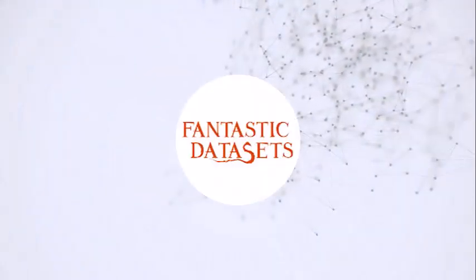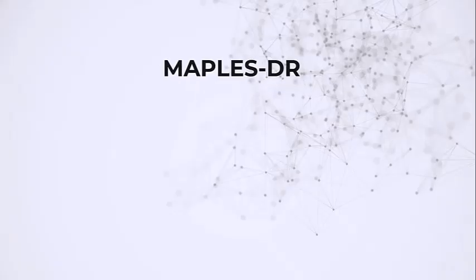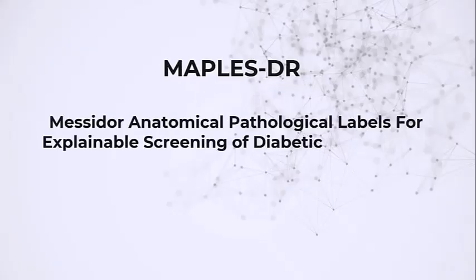Welcome to Fantastic Datasets and Where to Find Them. In this video we will talk about MAPLES-DR dataset. MAPLES-DR stands for Messidor Anatomical and Pathological Labels for Explainable Screening of Diabetic Retinopathy.